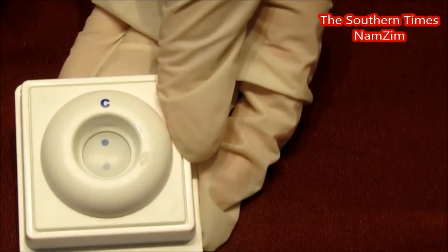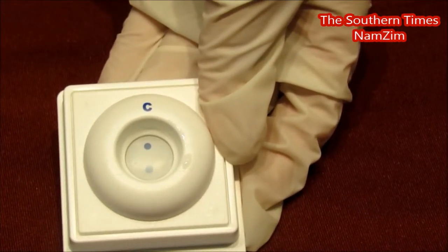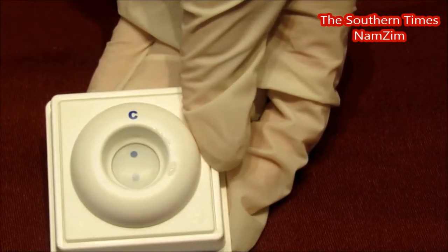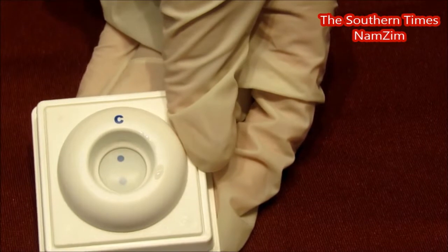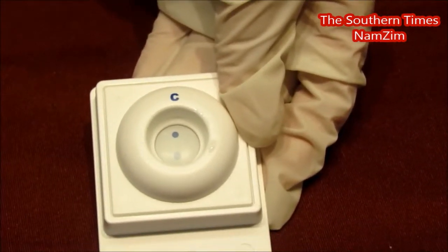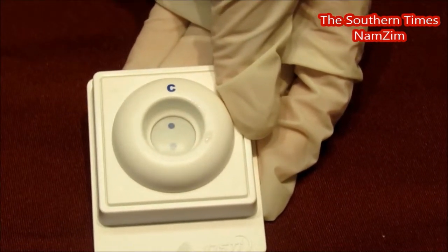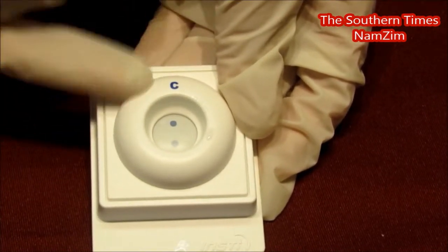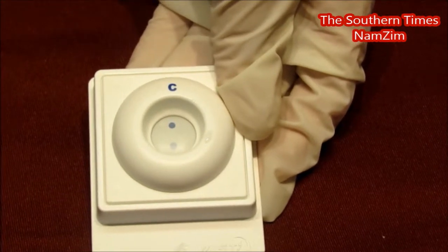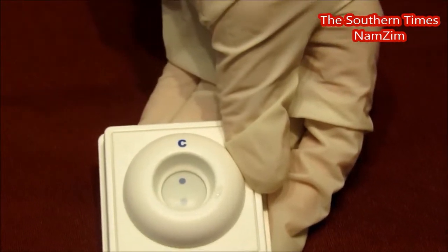Two blue dots means that you are HIV positive. It is a screening device, so you'd have to confirm it at a clinic. That top dot is for your control — that means you've done the test properly and added enough blood. The bottom dot is for HIV. So if you have antibodies for HIV one or two, you would display that second dot. Two dots for HIV positive. One dot at the control is HIV negative. If you didn't have any dots at all, then it would be invalid, and we request you go to the clinic.